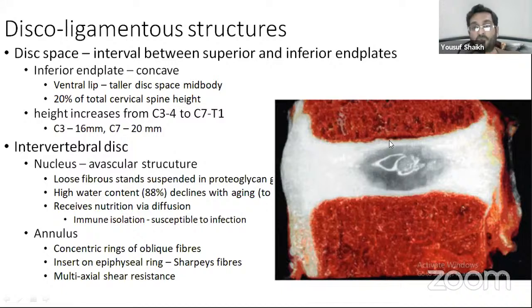Because pre-procedure, you need to be aware of what cages are available. And if you're doing a corpectomy, then a large pyramesh cage is needed. Because we know that in the cervical spine, the cages have to be slightly bigger than the designated disc space because we need to restore the normal lordotic curve. But over-distraction at the same time should also be avoided.